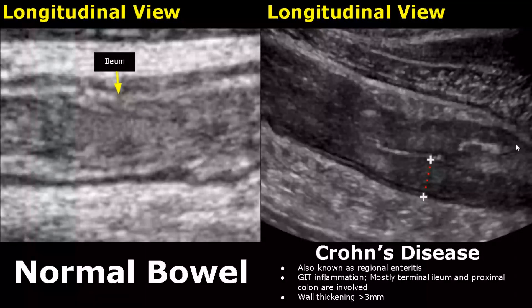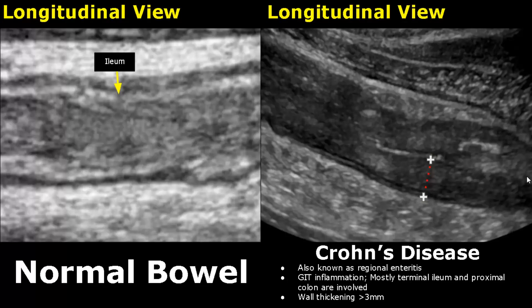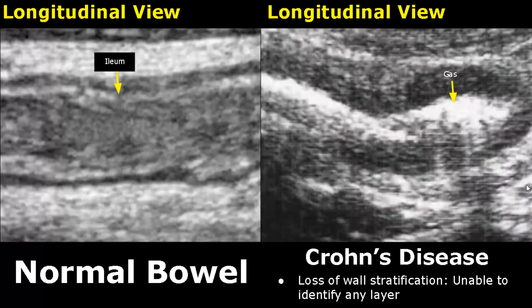Crohn's disease, which is also known as regional enteritis, is a GIT inflammation that mostly affects the terminal ileum and proximal colon. These images are of the ileum, and here we can see thick bowel walls — the thickness is greater than three millimeters. The loss of wall stratification will also be seen; we are unable to identify any layer of the bowel. This hyperechoic structure is gas, and there is some shadowing as well.